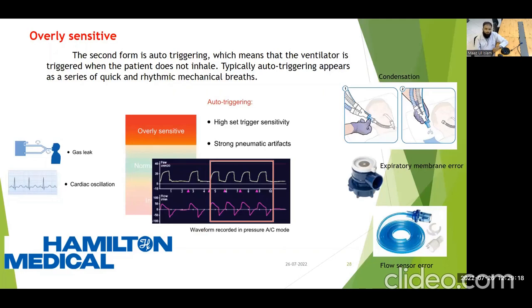Number two, overly sensitive. The second form is auto triggering, which means that the ventilator is triggered when the patient does not inhale. Typically, auto triggering appears as a series of quick and rhythmic mechanical breaths. You may notice that your patient is sedated and paralyzed, but the ventilator shows too many triggers.